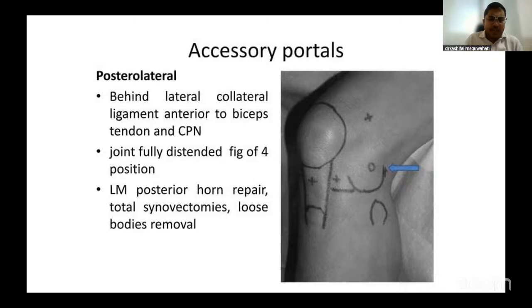What I was told by my seniors is you don't need to hesitate too much trying to make it so minimally invasive. If you're struggling, you can always go more lateral and medial to the classic portals to make your life easier in the beginning. Say it's a very obese patient, or everyone's knees are a little bit different when we're doing the cases. So we should not hesitate in making some portals that could help us in carrying forward our work.